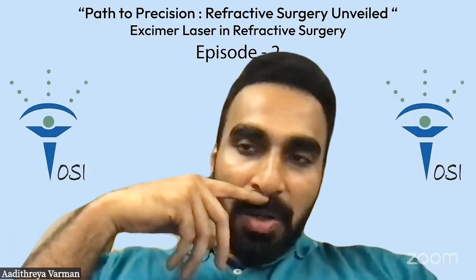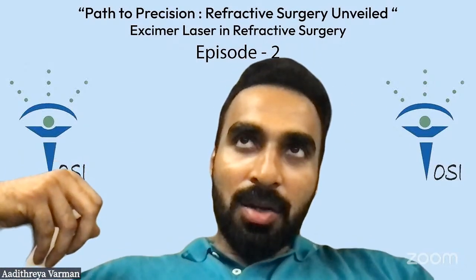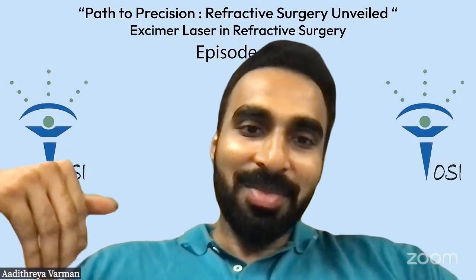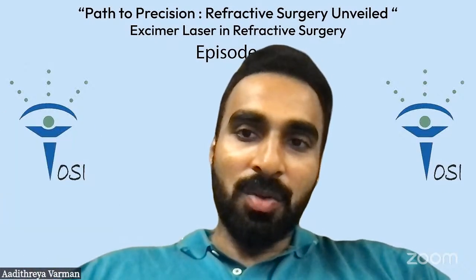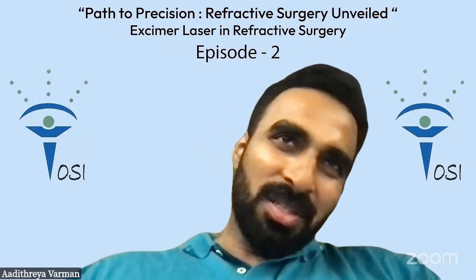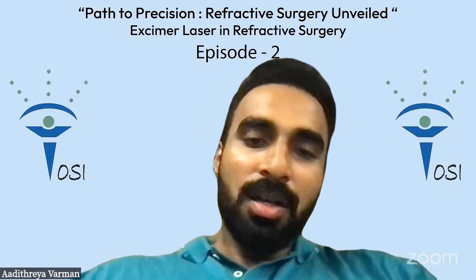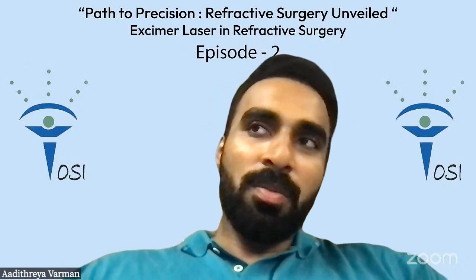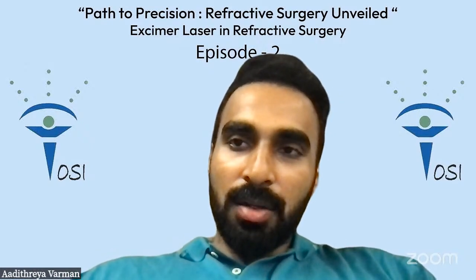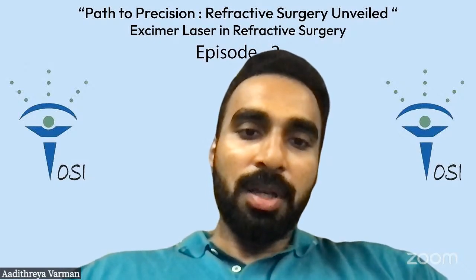And honestly, after doing Smile now for so many years, I feel that my cutoff for Smile is now coming down from -9 to about -7. So I'm moving more towards ICL as we do more numbers, because I see sometimes there's epithelial remodeling. There is a mild cylinder coming back later. So then 2 or 3 years later, I feel, oh, this would have been better if I had done ICL. And the other thing is, the patients ultimately come for you. They don't come for your procedure.